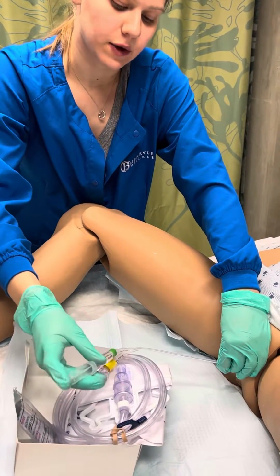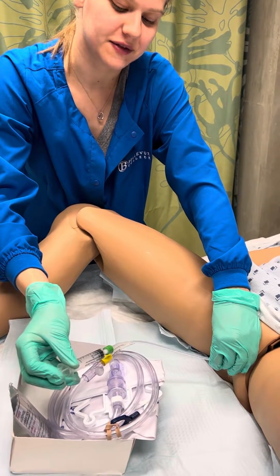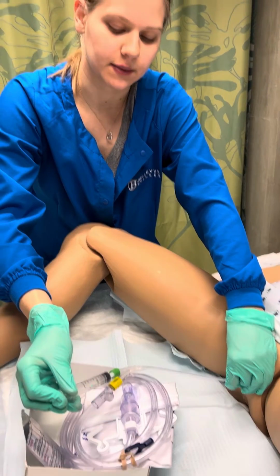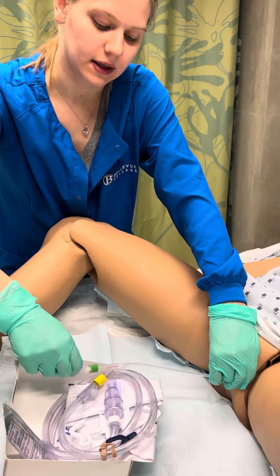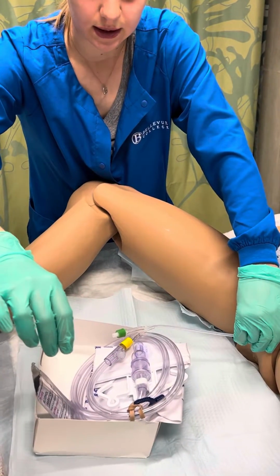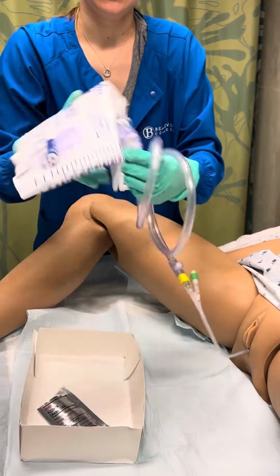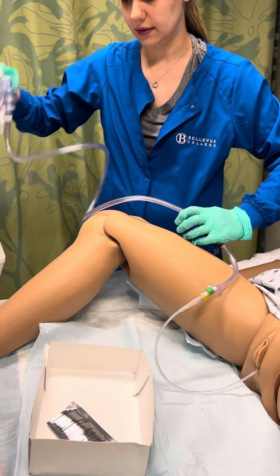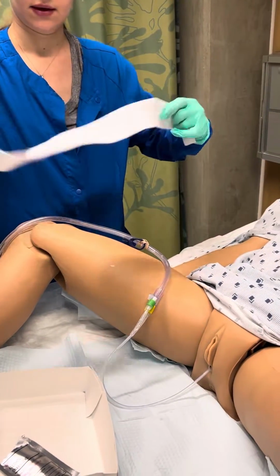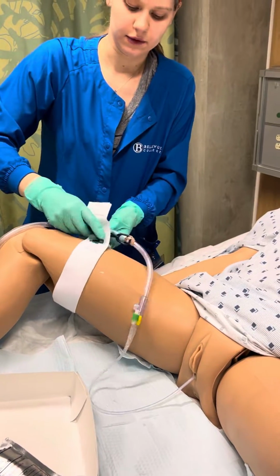Now that I've advanced 2 more inches into the bladder, I inject 10 mL of sterile water while stabilizing the catheter with my non-dominant left hand. And then I disconnect my syringe. That is trash. And it is firmly in place. I label the bag appropriately. And I can set this here, and I'm going to secure the bag with a catheter securer, or I could also use tape when appropriate.